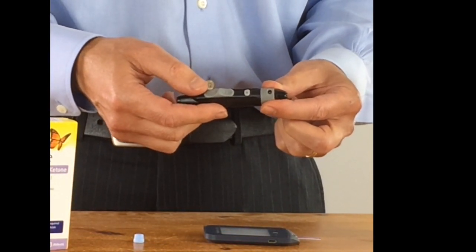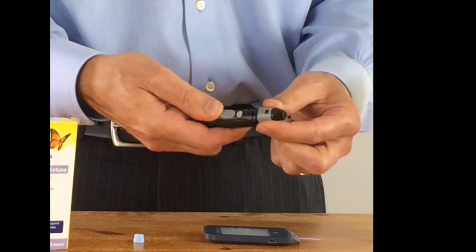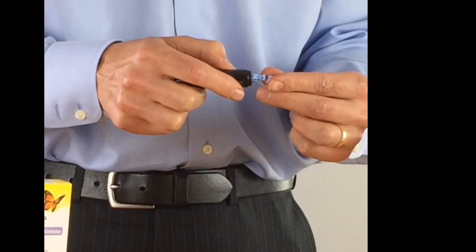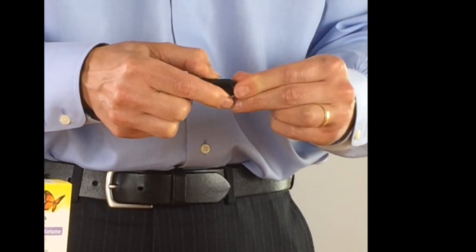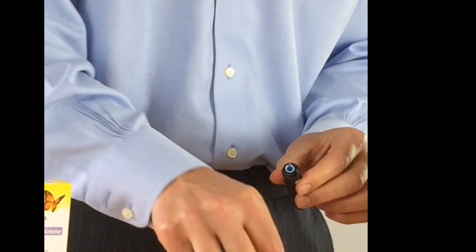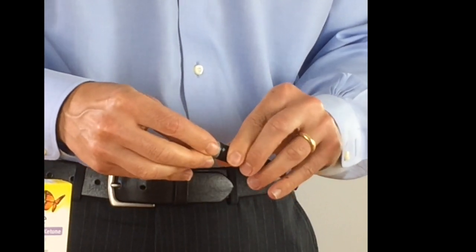After that, you need to dispose of your sharp. So again, pop this off, put the round part of the blue to cover the needle, and then you can take that out and safely dispose of the lancet without it affecting anybody else.